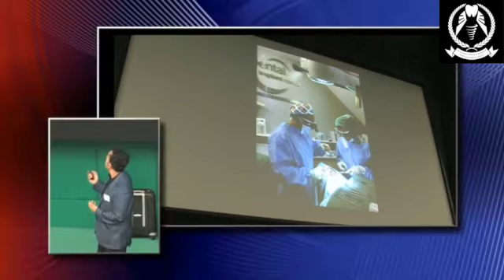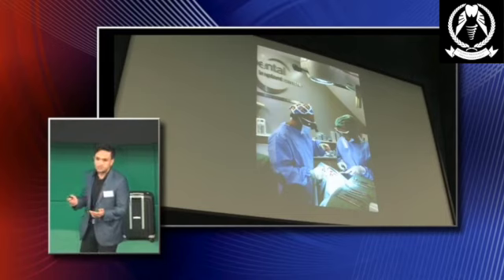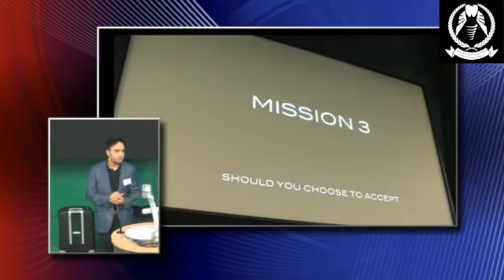I'm fortunate to have a surgical light in my operatory as well, so we need lots of light and shadowing as we're placing things in 3D. So just an insight a little bit to how we kind of do it.